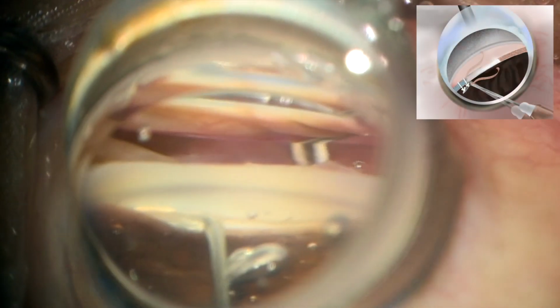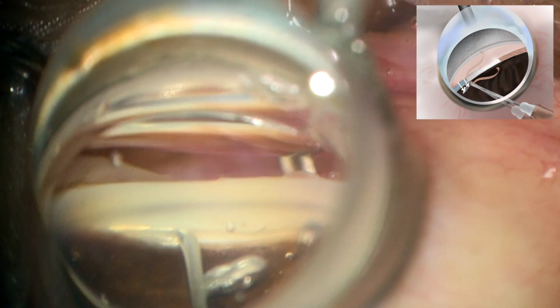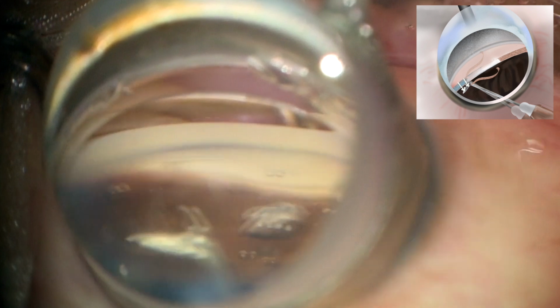At the end of the goniectomy, the needle is pulled centripetally to incise the strip of trabecular meshwork. This prevents its future reattachment and failure of the goniectomy. The needle is taken out and the visco-cohesive agent is aspirated with a coaxial IA handpiece.